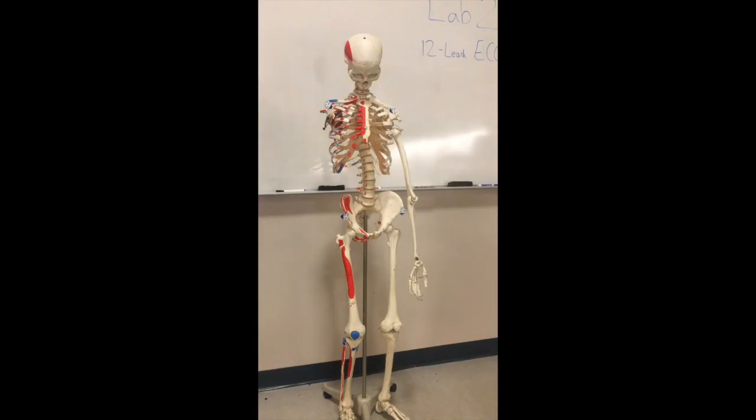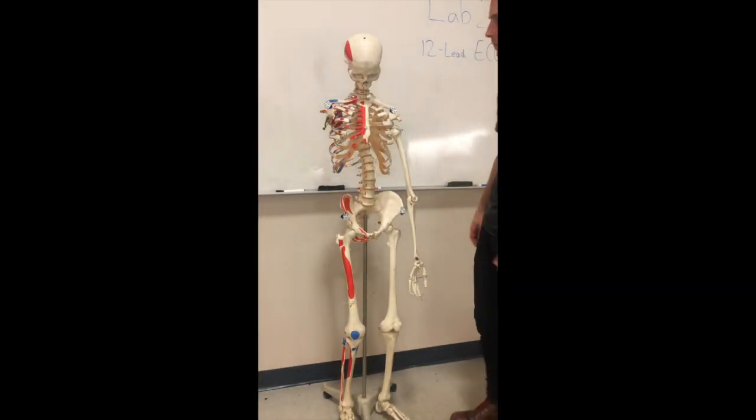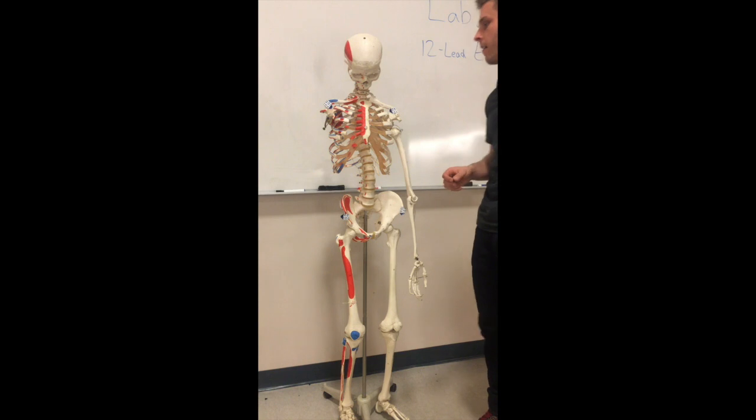Okay, so now we're going to show the placement of the 6 chest electrodes. These 6 chest electrodes are going to create another 6 views of the heart, which is going to lead to our 12-lead ECG. Okay, so it's easiest to place the electrodes on the chest in order of 1, 2, 4, and 6, and then place 3 and 5 after to fill the gaps.